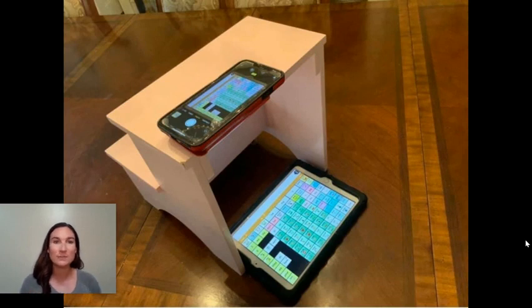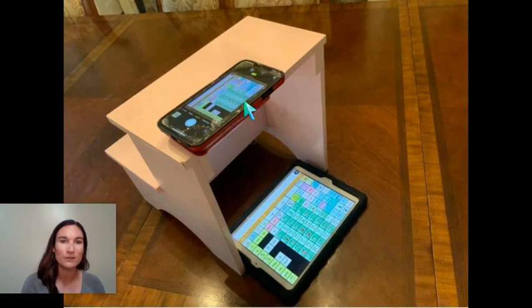This is Christine's setup. That's just a step stool. So this one is nice and high, so you can see on the phone that it gets this really good view of the system. And then you could also see your hands activating the buttons really clearly.